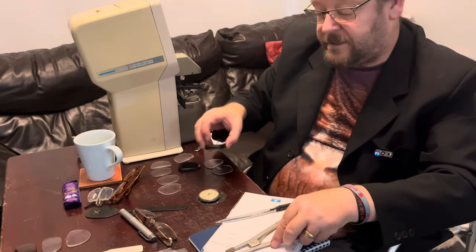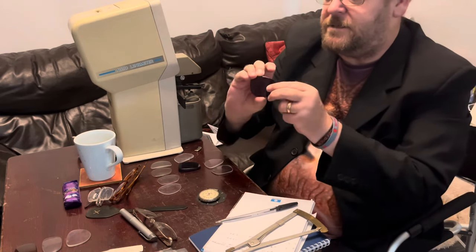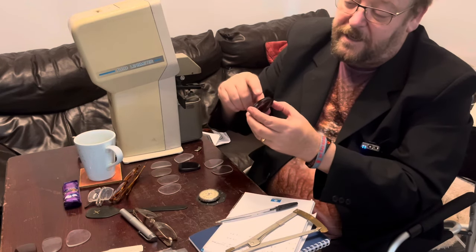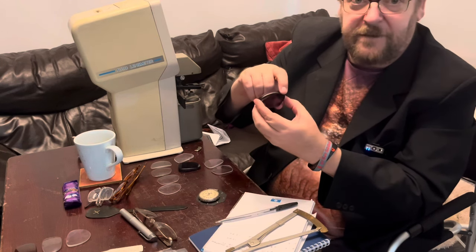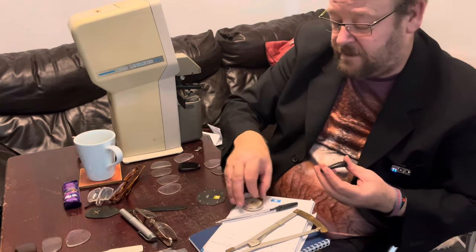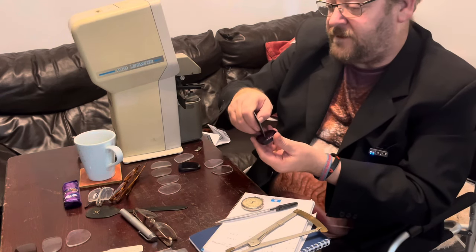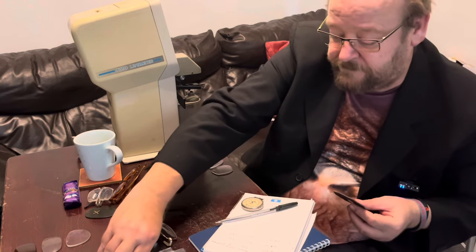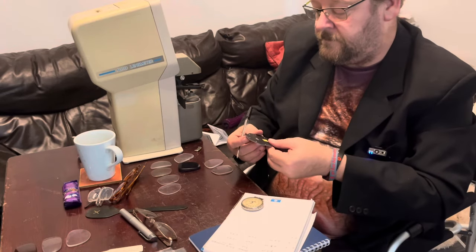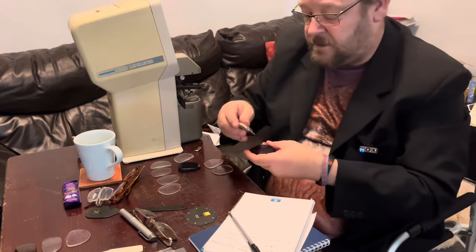Now I'm looking at lens D. Lens D is a nice sunglass dark tint and we can see it's a minus prescription. It's got a flat front surface and it's got a nice concave curve at the back. So this is going to give me some totally different readings. This one on the front is definitely a number one — it's very flat. So I measure the front surface.